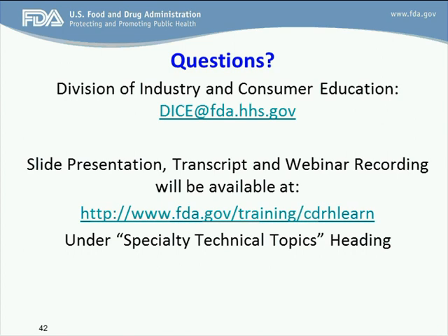Hi, thank you very much. I have three questions. The first is from Criterion 5, the section that refers to reduction of sterilant residuals. It refers specifically to EO and to hydrogen peroxide, and there's a reference to ISO 10993-7 for acceptable levels of EO residuals. Do you consider that acceptable levels of hydrogen peroxide residuals have been established, and if so, do you have a publication to which you refer for those?